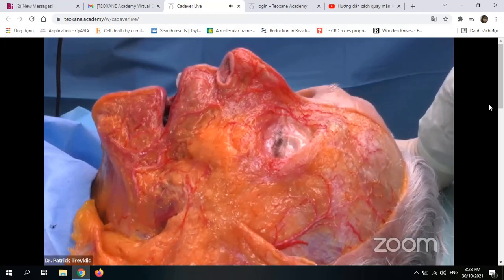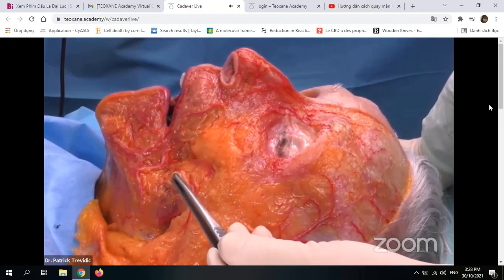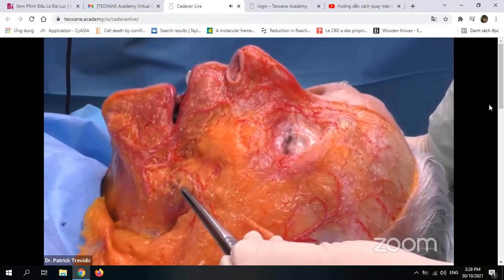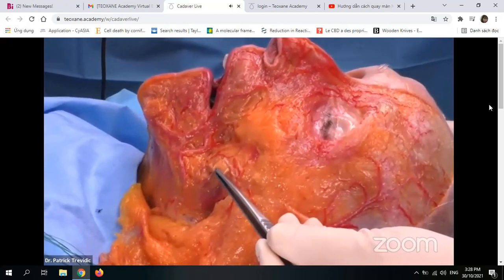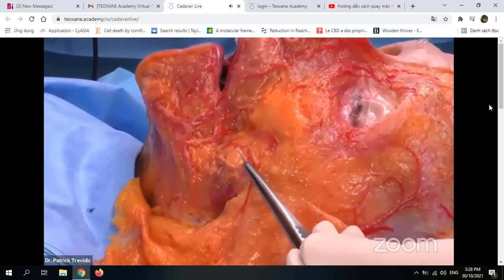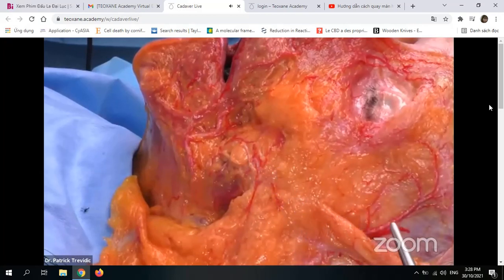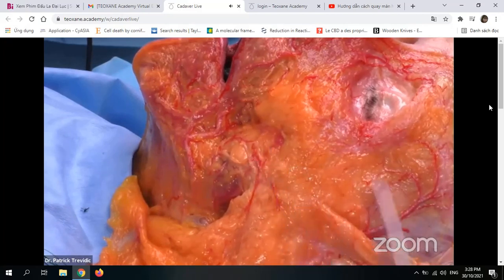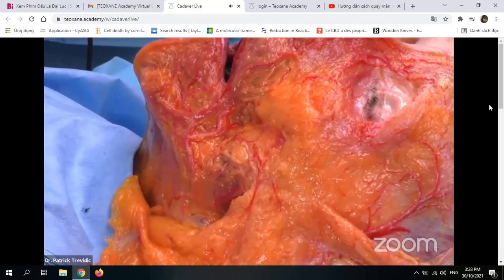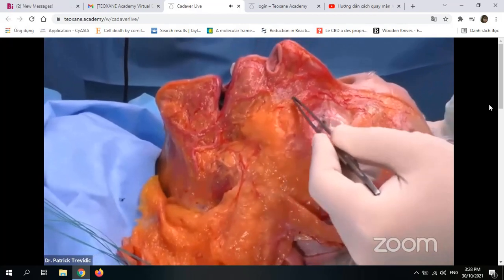And here you see a specific thing here. You know what that is? That I can pull on, as you can see here. This is the Bichat fat pad here. And you see just above the branch of the facial nerve, and you see also the parotid duct that is just here above the masseter muscle. And you get, if you dezoom a little bit here, the deep fat compartment where Nabila will inject it.